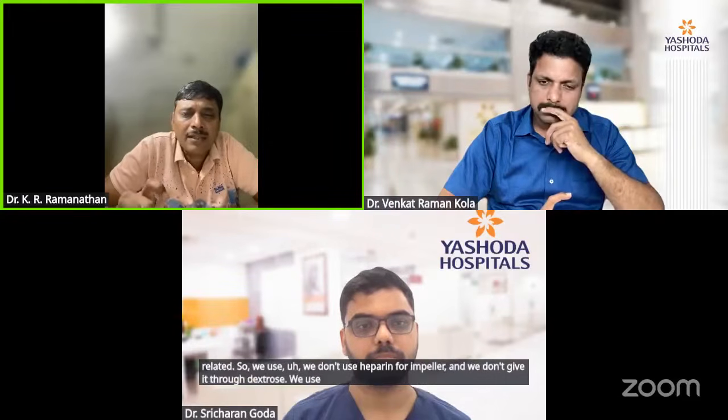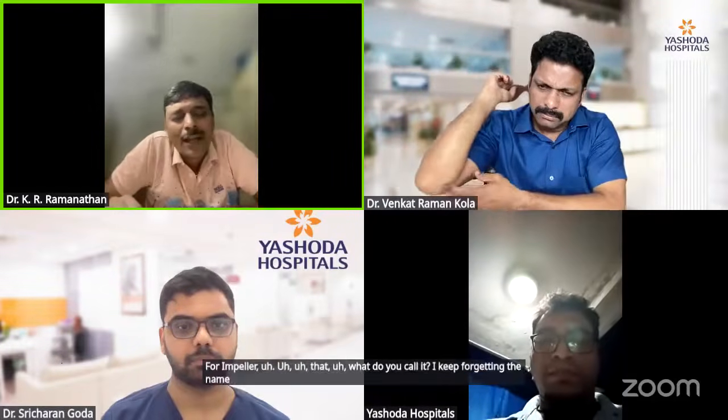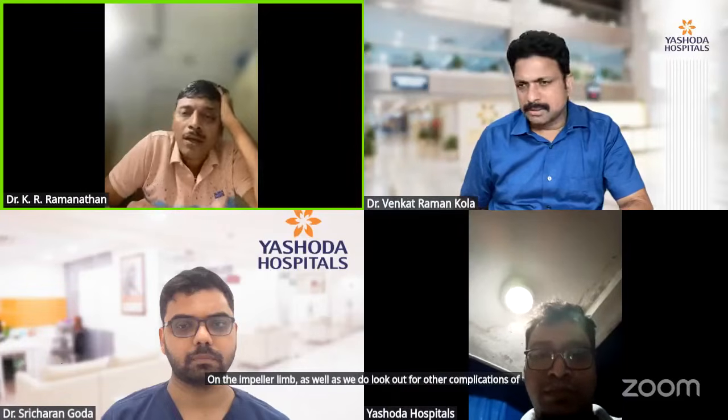The other few things essentially are anticoagulation related. So we don't use heparin for Impella, and we don't give it through dextrose. We use bicarb-based fluid for Impella. What do you call it? I keep forgetting the name. That infusion. And the second thing is we monitor for limb ischemia on the Impella limb, and we also look out for other complications of Impella, like hemolysis and others.